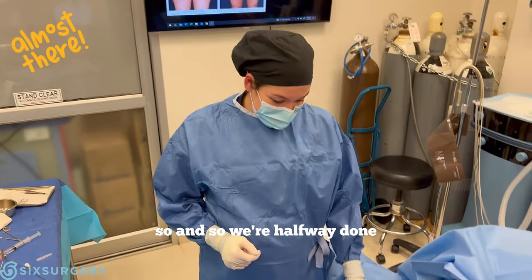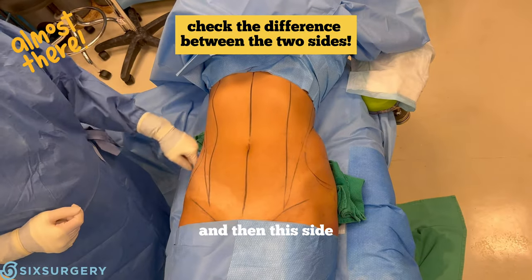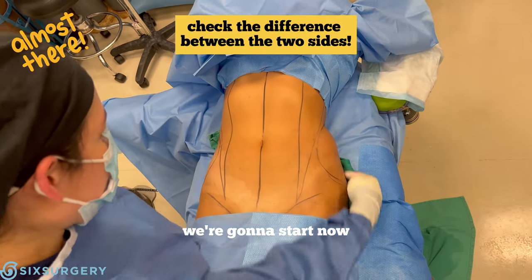We're halfway done. Come take a look at this dramatic curve — just beautifully scooped in here. Now we're going to start on the other side.